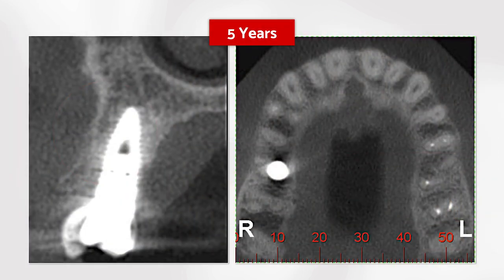The CBCT scan after 5 years. Take a look at the thickness of the buccal wall and the thickness of the palatal wall.